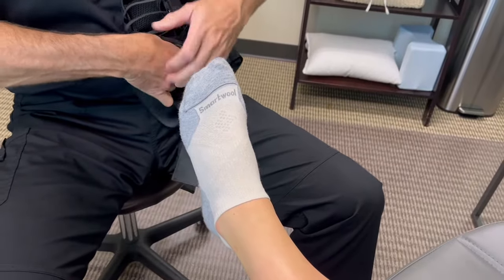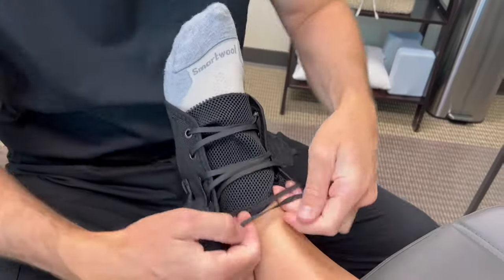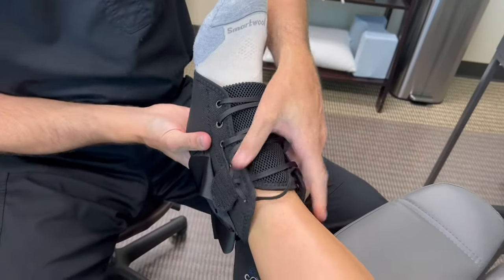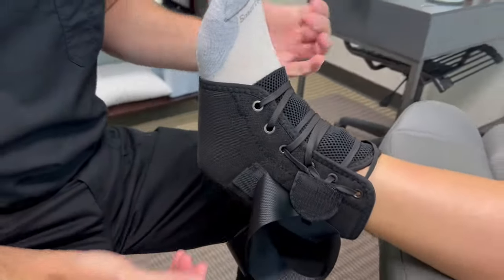Once this is loosened up, you want to just slide it on. Once it's on, you want to make sure that the tongue is up all the way, and this is all the way up so the heel comes right through this little hole back here.